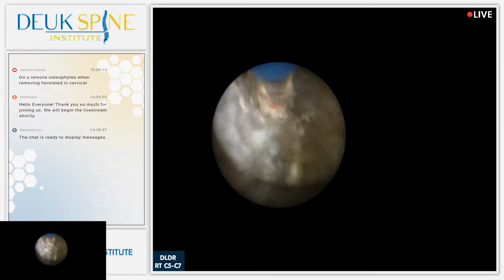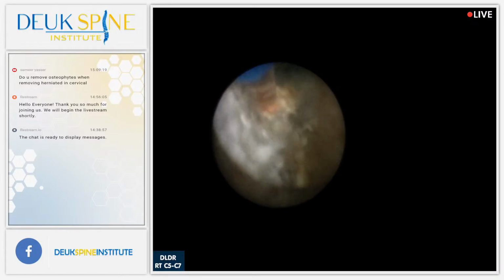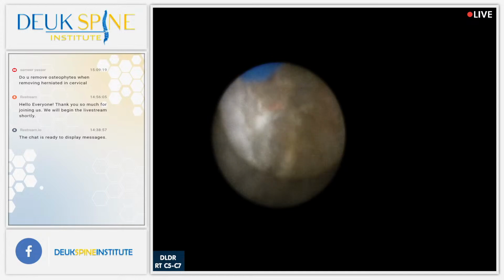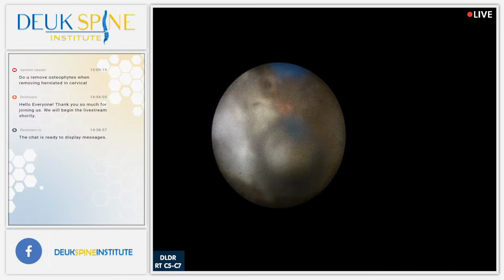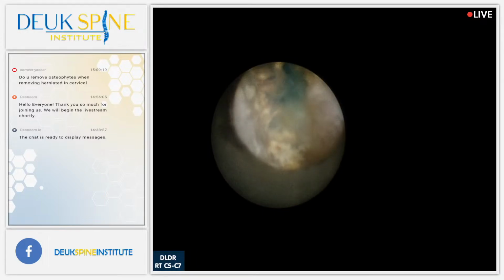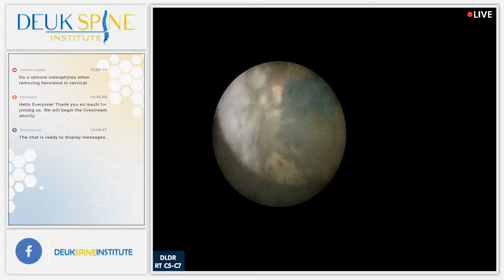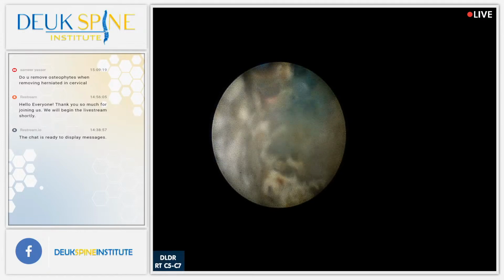All right, now you understand why these herniations cause so much pain. It's inflammation, and inflammation over time, a long time, leads to bone spurs like these. These are ginormous bone spurs here, and I've been whittling them down with a laser, all of these, and some of them I had to take out, some we don't have to, we're going to leave because they're not safe to remove or they're not causing symptoms. But this is herniation right here.